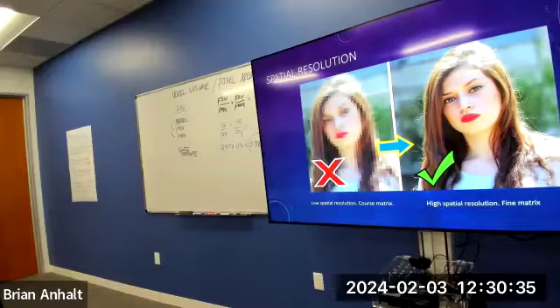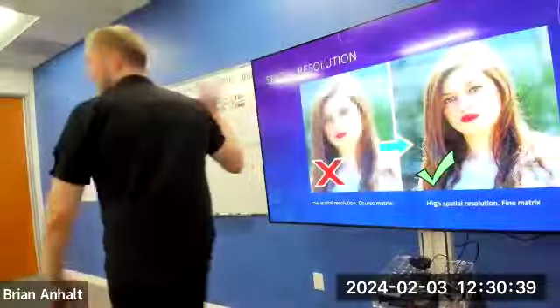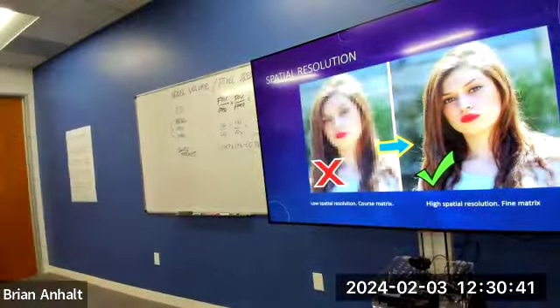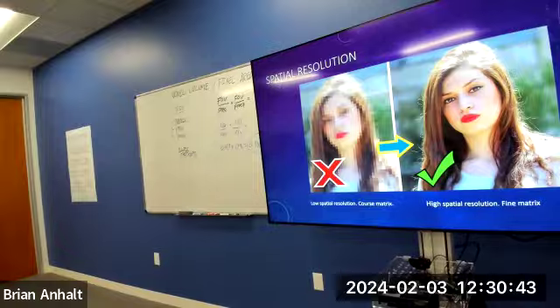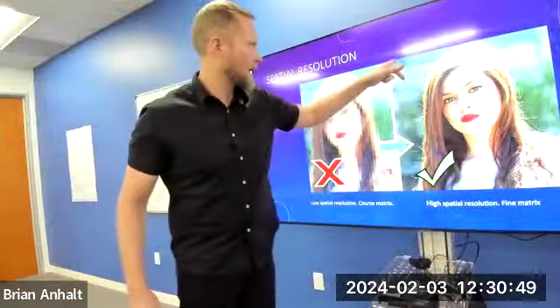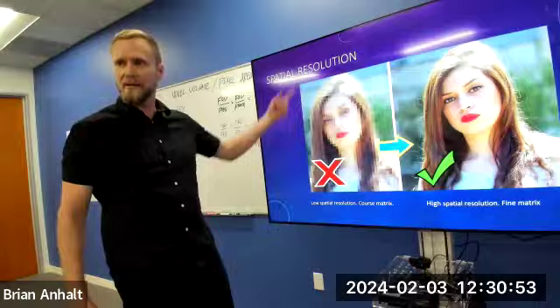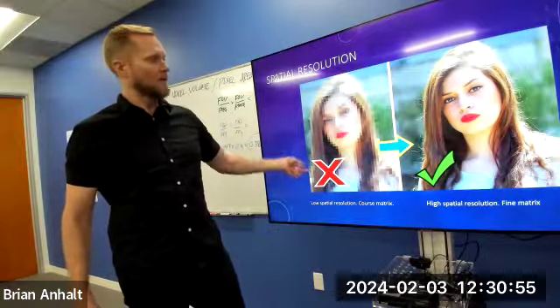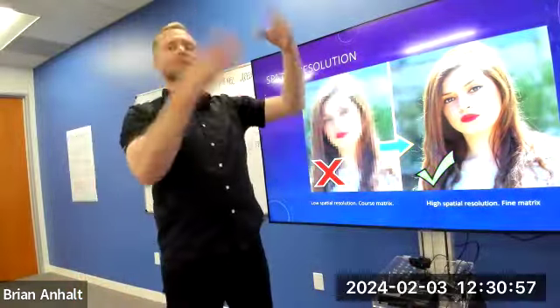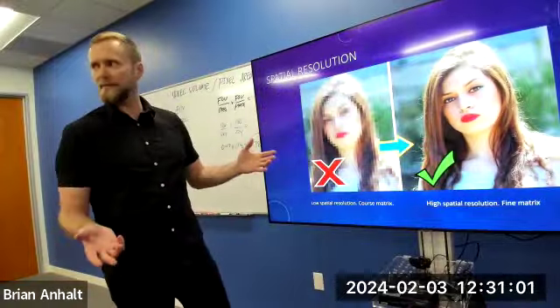On the right, 100% this one, right? We can see a lot more detail here than we can here. Same thing with MRI. We get smaller pixels and smaller voxels, we're going to have much better detail, much better resolution. High resolution picture, I can't even count the amount of pieces this one is divided into. This one you could literally go and count and figure out what the matrix is. So a very fine matrix, very high number on your matrix, versus a very low matrix, the field of view is exactly the same, right?